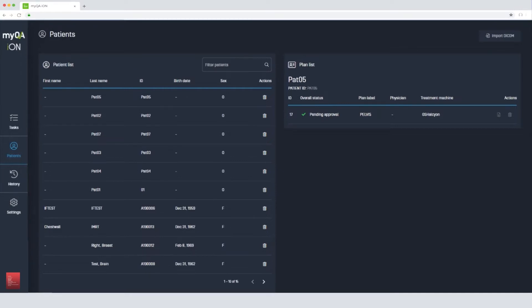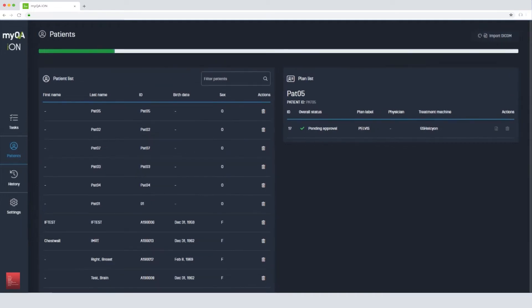Let's perform a plan verification together. First, we need to import a plan. To perform a recalculation of the dose for an independent dose check, all the DICOM objects from the plan must be exported from the treatment planning system to MyQA ION.